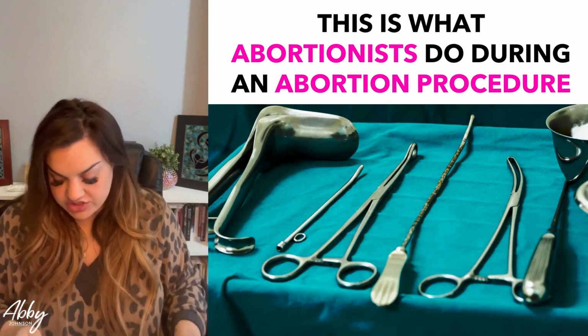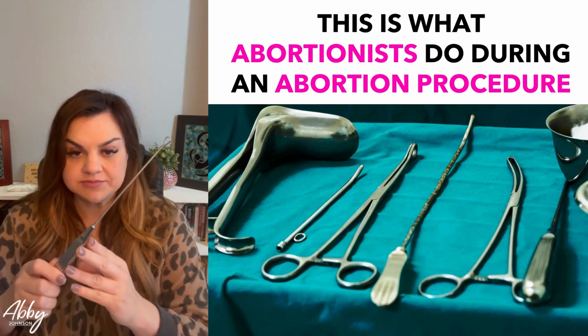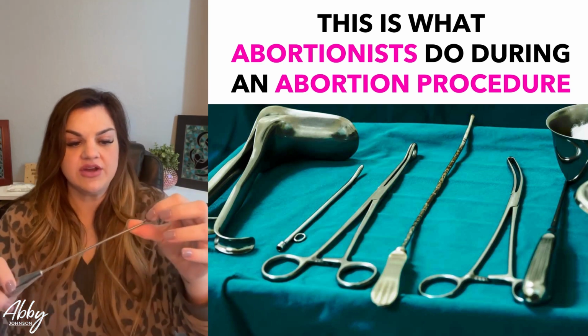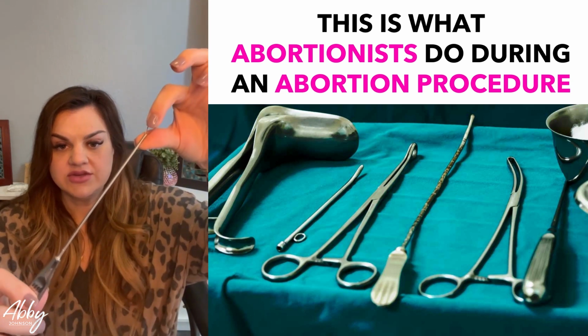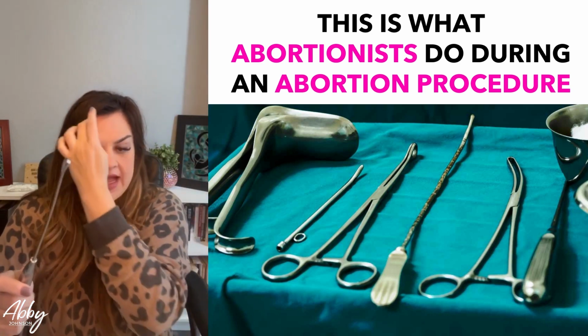After everything is suctioned into that tube, they're going to use this. This is called a curette. These come in various sizes, but this is a pretty typical size. This is very sharp on the end. So you can see it's circular on the end, and this is very sharp right here. And so this is what they take after the suction.